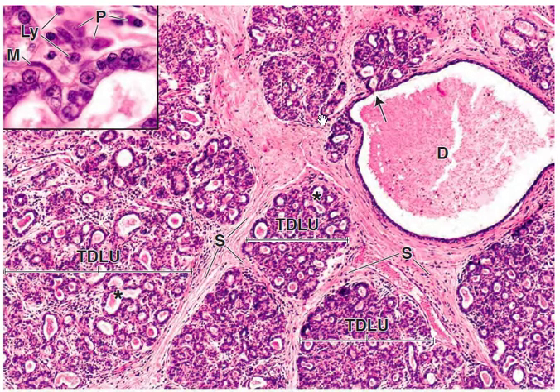So let's look at this picture. Whereas the development of the duct elements in the mammary gland occurs during the early proliferative stage, the development of the alveolar elements becomes conspicuous in the late proliferative stage. This figure shows the terminal duct lobular units at the late proliferative stage. So here, here, here. Individual lobular units are separated by narrow, dense connective tissue septa.